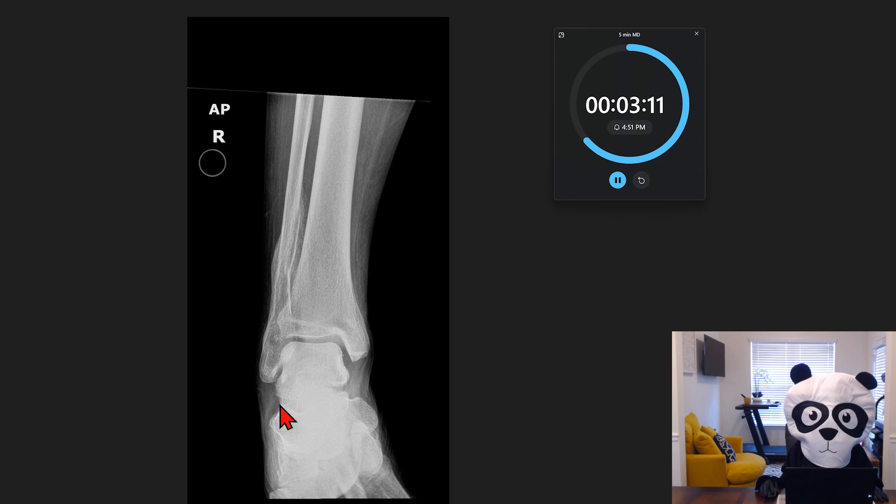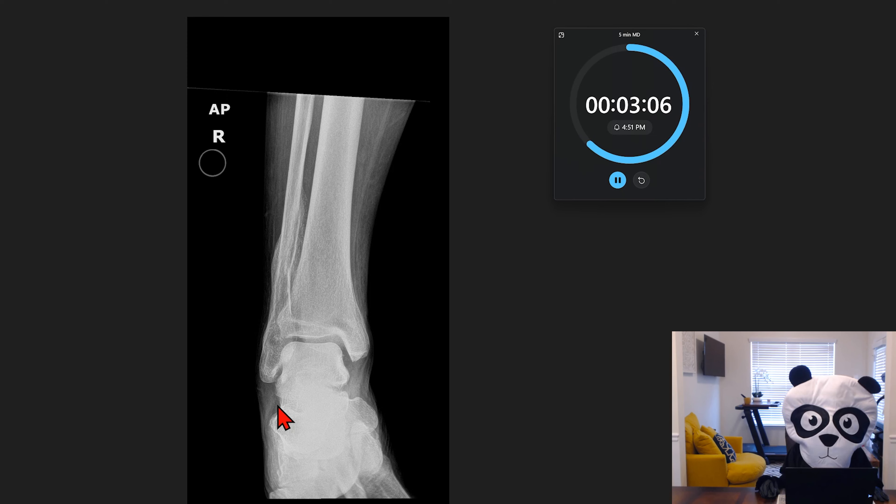If we were to write out an impression for this exam, we could say no acute finding, chronic distal fibular post-traumatic deformity.